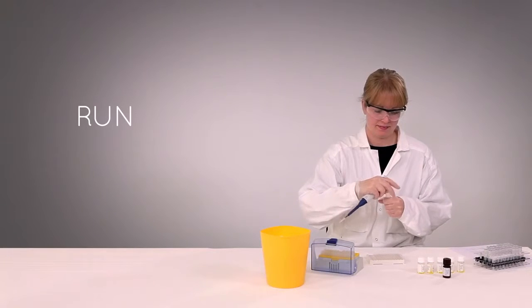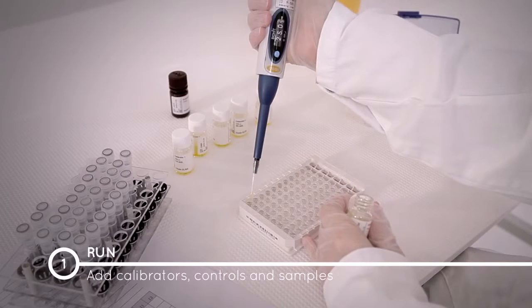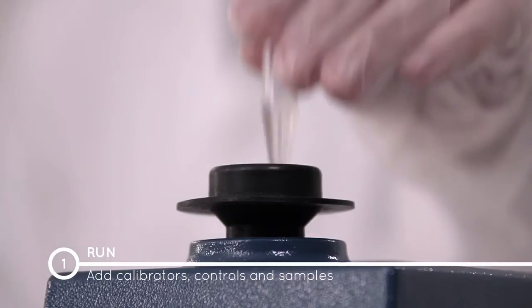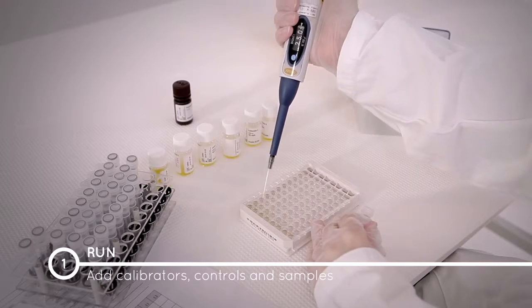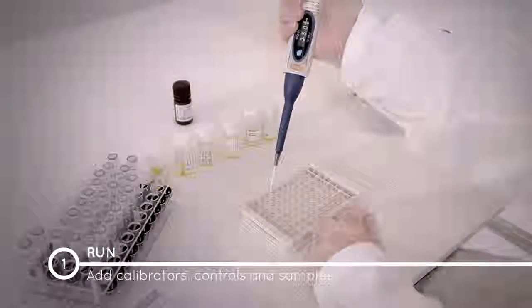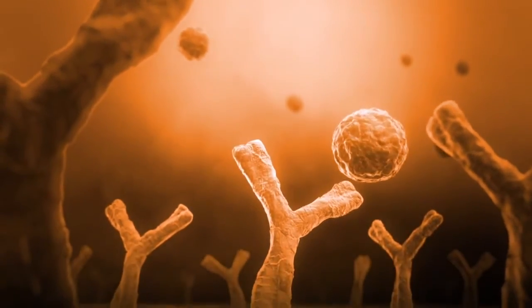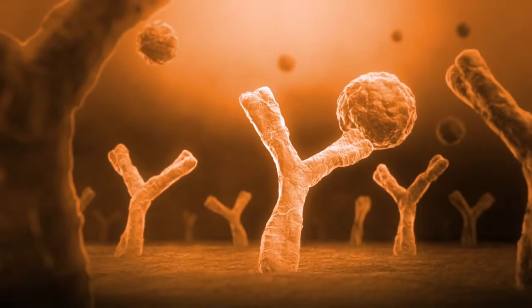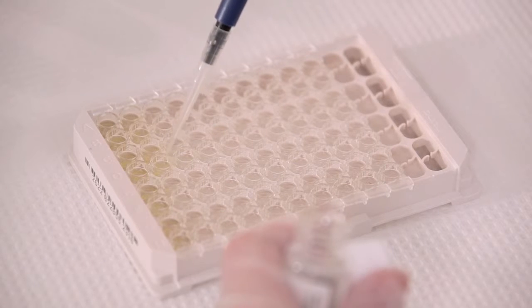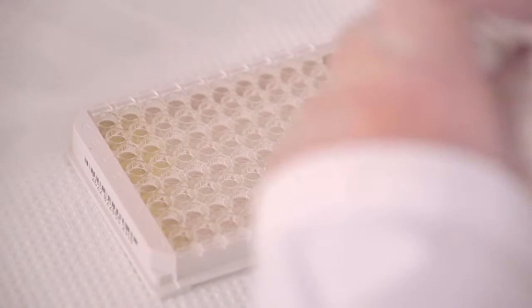Now pipette 25 microliters each of calibrators, controls, and samples into the appropriate wells. Each calibrator, control, and sample should be run in duplicate for quality assessment. Once the first incubation starts, insulin in the calibrators, controls, and samples will bind to the monoclonal capture antibody that is bound to the ELISA plate wells. The calibrators are yellow and can be seen clearly in the wells. The samples and controls are colorless.